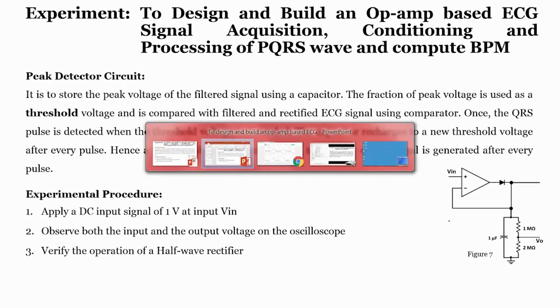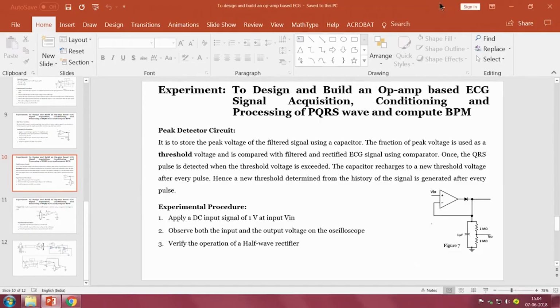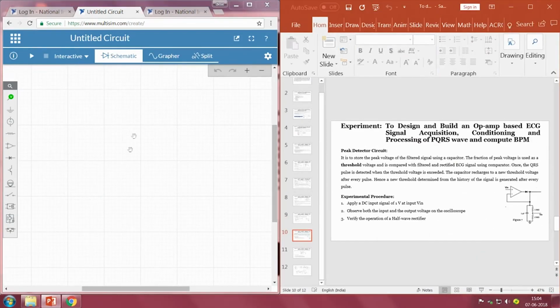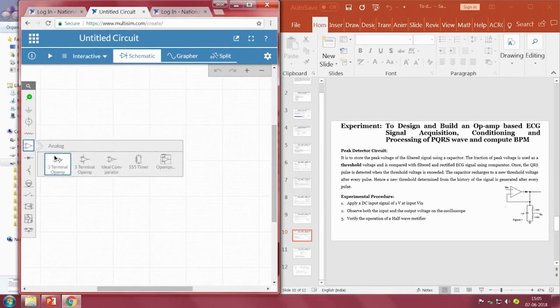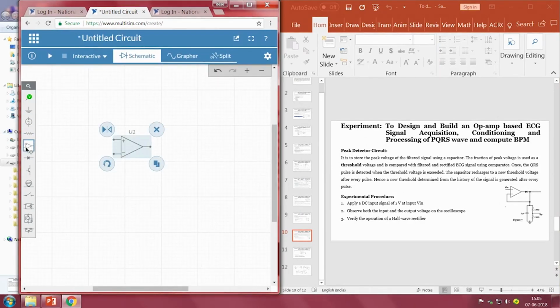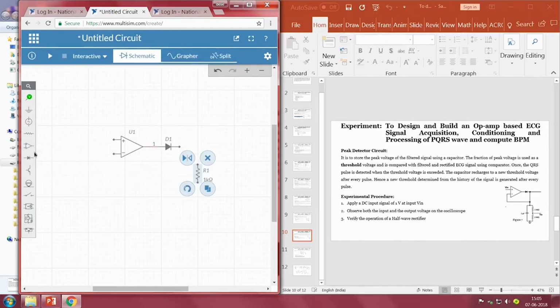So, just open Multisim. If you recall the circuit that we have discussed, we need this particular part. So, I will take an op amp, right, and I need a diode, so I will take a diode. Then we will take resistors as well as a capacitor. I am taking a resistor, one more resistor and a capacitor too. So, the capacitor is also there, then this resistor, right. So, these two have to be connected together.